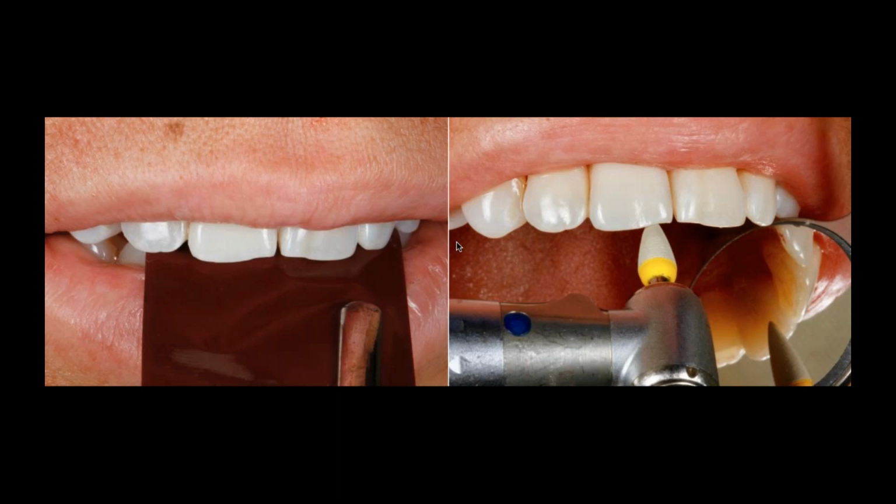Okay, and always polishing zirconia will help us maintain a better surface on the opposing dentition. Zirconia is very hard, but if it's smooth, it's not harmful at all. So always use the red line fine diamond bur when adjusting the monolithic zirconia, and then use the low speed polishers, two steps. I use the Brasseler kit to make sure that I finish with a smooth surface on the zirconia, and that will avoid any wear of the opposing dentition.